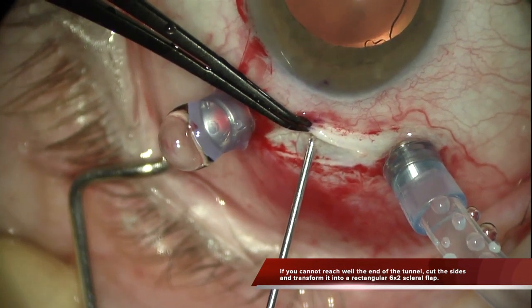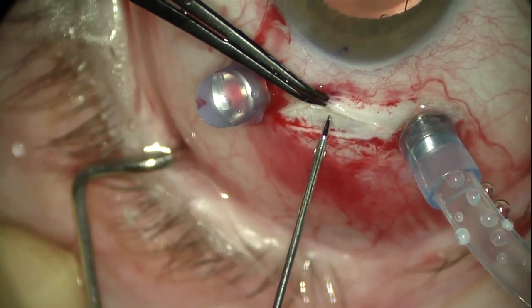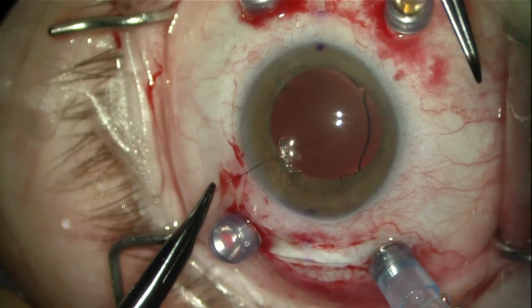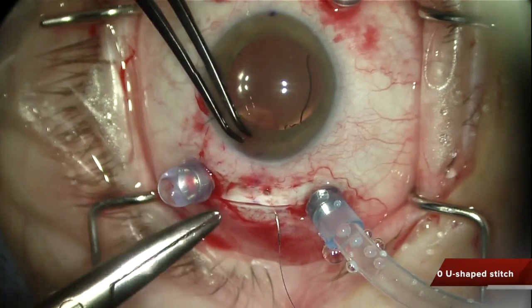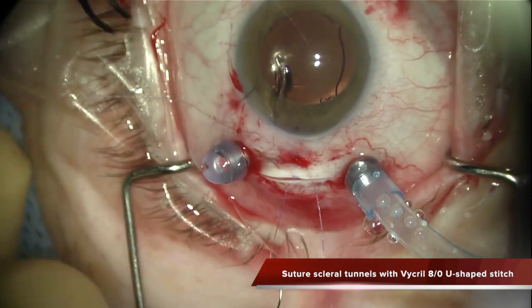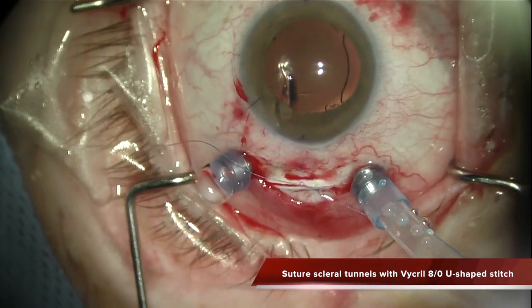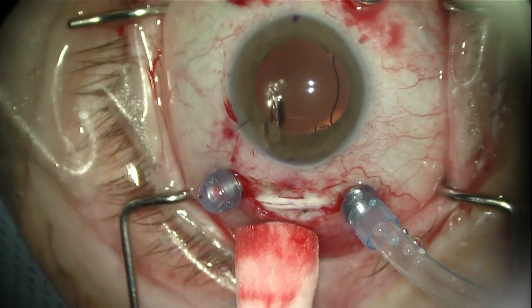Once the plug is extracted, you can observe that it is buried by itself at the end of the scleral tunnel. The only thing you have to do is suture — you may even leave it and suture — but in order to get a better closure and avoid any chance of leaking, what I am doing is passing a U-shape stitch with an 8-0 Vicryl that is going to close completely the scleral tunnel, promoting scarring and avoiding any risk of plug extrusion.